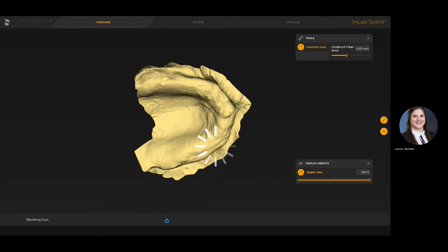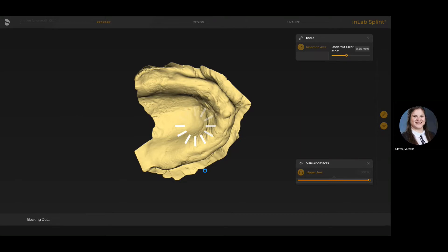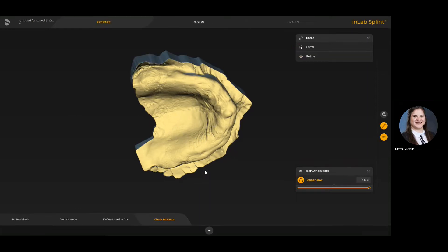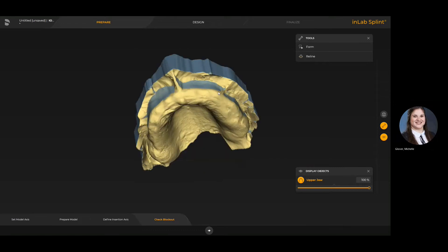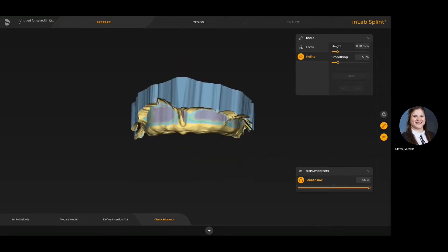Typically with a custom tray we seat it more posteriorly and then bring it into the anteriors for the impression, so we want the insertion path to reflect that same insertion. Once that is defined and we move forward to the block out stage, it's automatically going to block out any undercut visualized in the previous step. If we want to see where those undercut values are, we can turn on the reline tool, which will show us the color mapping so we can see exactly what the software has covered with the block out material.